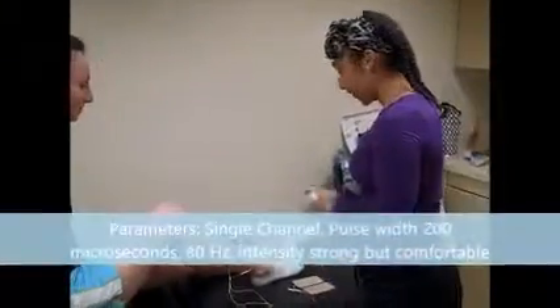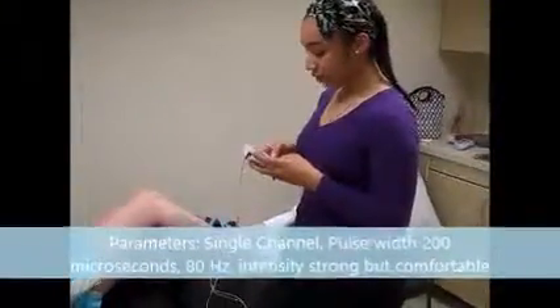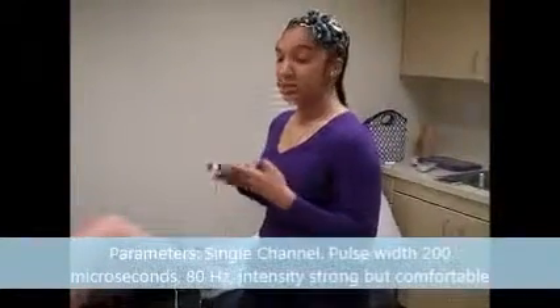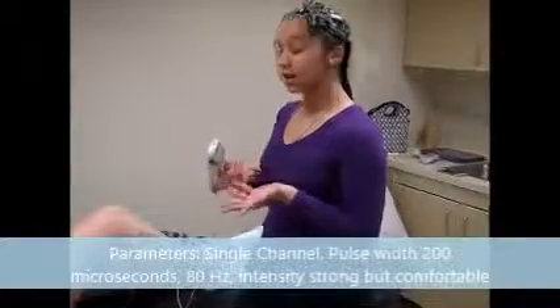The pulse width is going to be set at 200 microseconds with 80 hertz, as well as an intensity level that's going to be adjusted according to the patient.